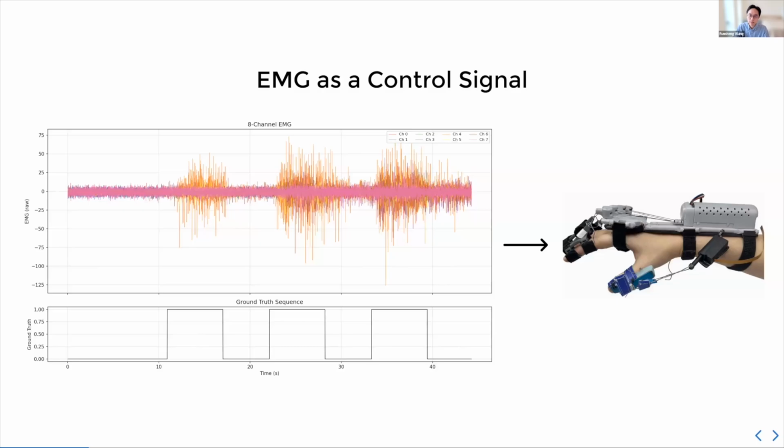Signal is still present. Yes, so the signal is still present in the EMG. And I'm showing you here an example of our stroke subject. Here you see 3 segments of high activity, corresponding to an opening gesture, interspersed with relaxes in between. And we're trying to use essentially this to control the device.